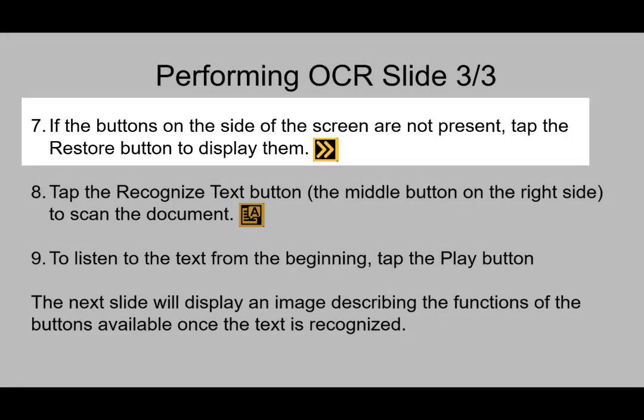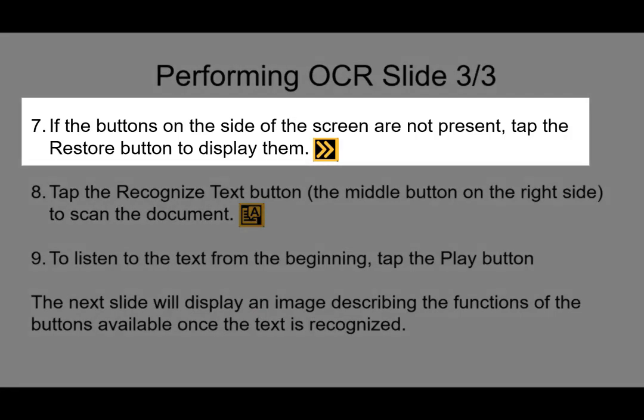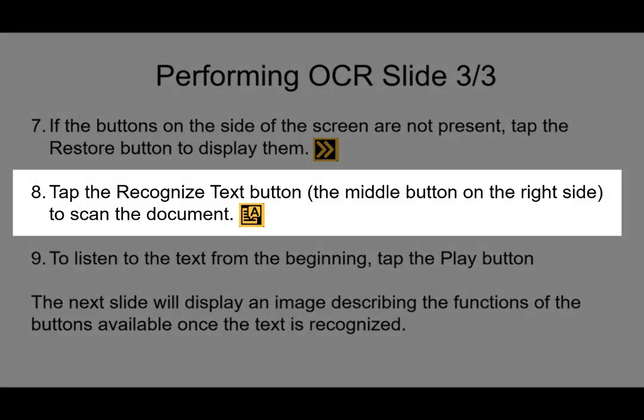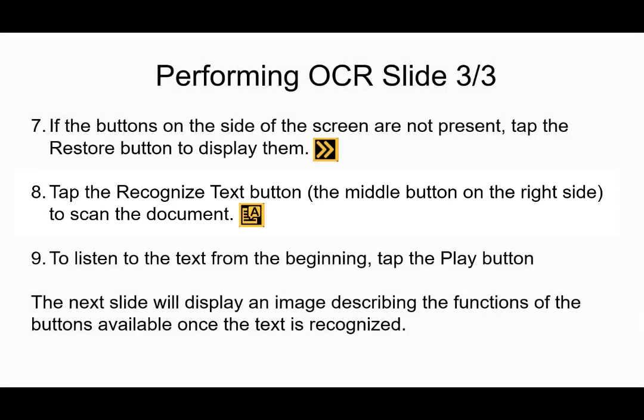If the buttons on the side of the screen aren't present, tap the restore button in the lower left-hand corner to bring them back. If they are there, no action is needed. Tap the recognize text button, which is the middle button on the right side, to scan the document. The Juno needs to perform the OCR, and this button is what triggers that. Otherwise it's just a captured image and won't pull the text from it, so pressing the recognize text button is extremely important.